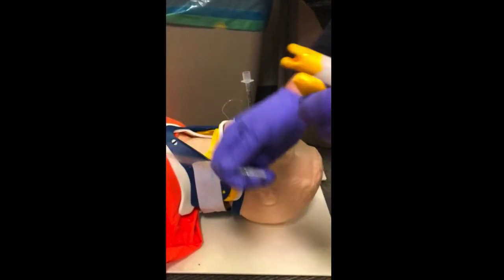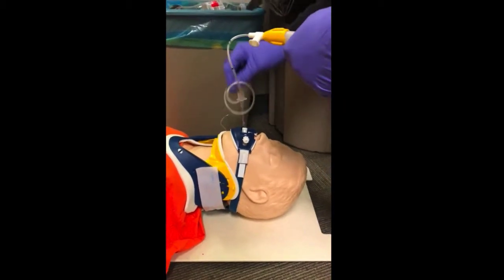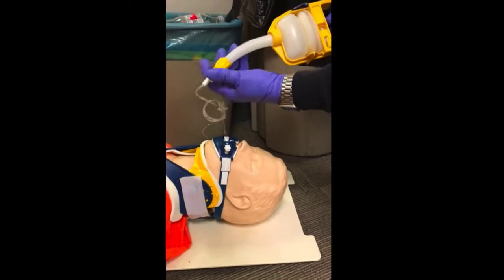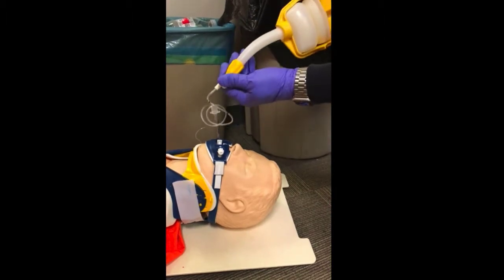Or if you want, you can pop out the tube that comes with the V-Vac and just use that special adapter tip. Hook it into any regular suction catheter, feed your catheter in, and then you'll need to close the thumb valve — the valve right there.